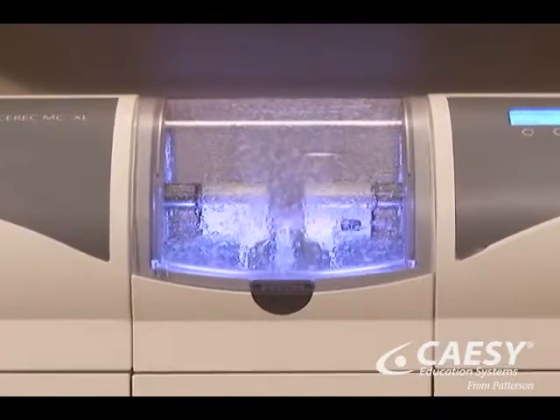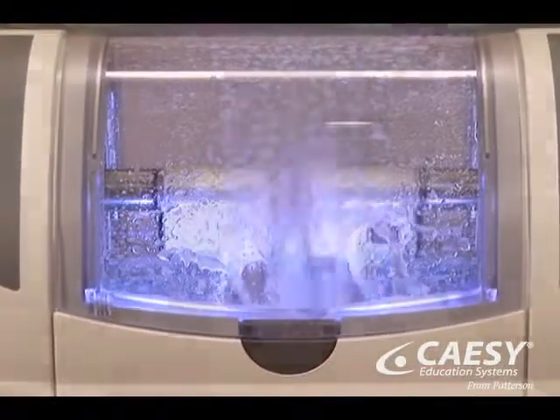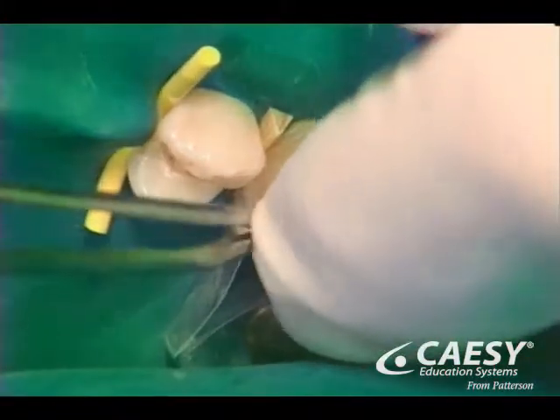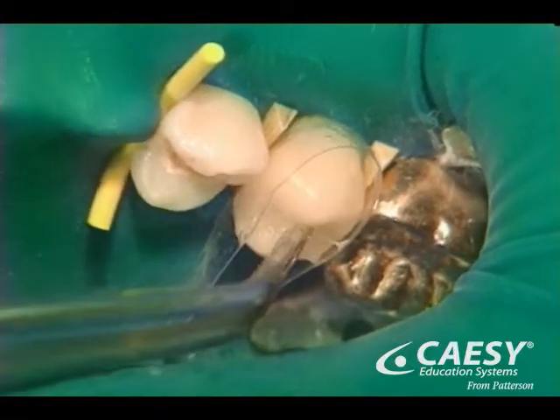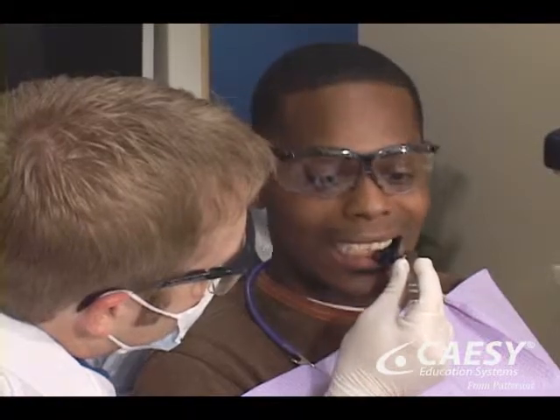We place this material into the milling machine, which in just a few minutes shapes it into a custom-fitted restoration. We then try in the new restoration, add any necessary coloring, bond or cement it in place, and polish it to a beautiful luster. Last, we'll check your bite and make any final adjustments.